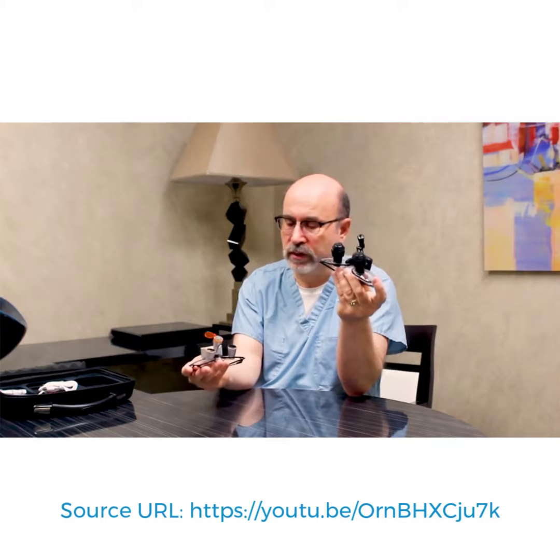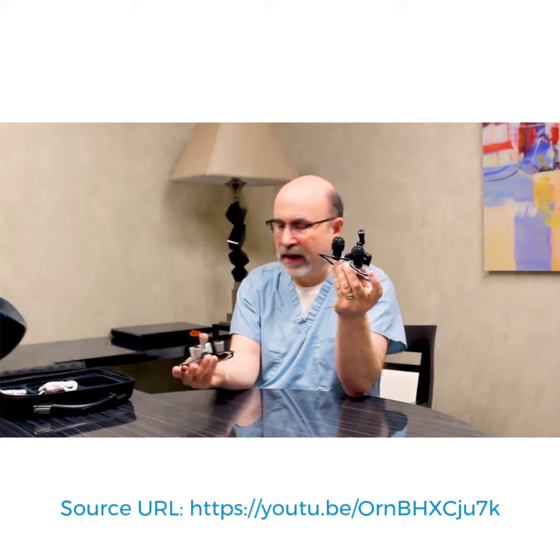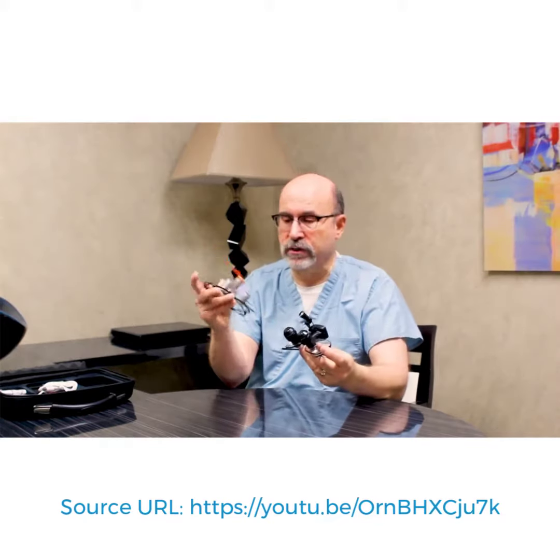It does exactly what it's supposed to do. You're going to have the same optics and the same — it just magnifies perfectly. That part's good. I have a tough prescription and they did a good job putting that in as well.